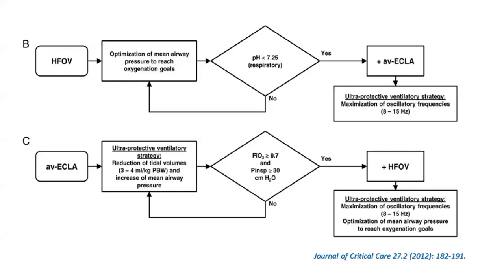And we move to ECMO faster than using high frequency, because we know that high frequency might affect the hemodynamics more and put the patient in a bad condition. So when we have a patient whose cardiopulmonary interactions are affected because of cardiac function, we go to ECMO. It is not because of the availability of ECMO. That's my impression about high frequency.